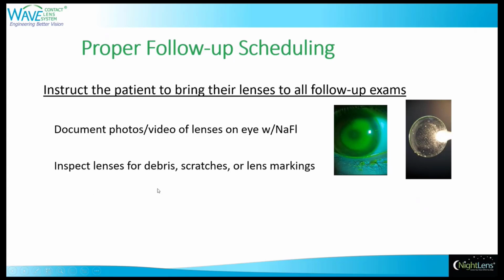Inspect the lenses for debris, scratches, or lens markings. So some manufacturers use the same color for both lenses, but just have different markings on the lenses if the lenses are in fact different. So there is a possibility of the patient switching lenses on their eyes, and that certainly will affect the treatment.